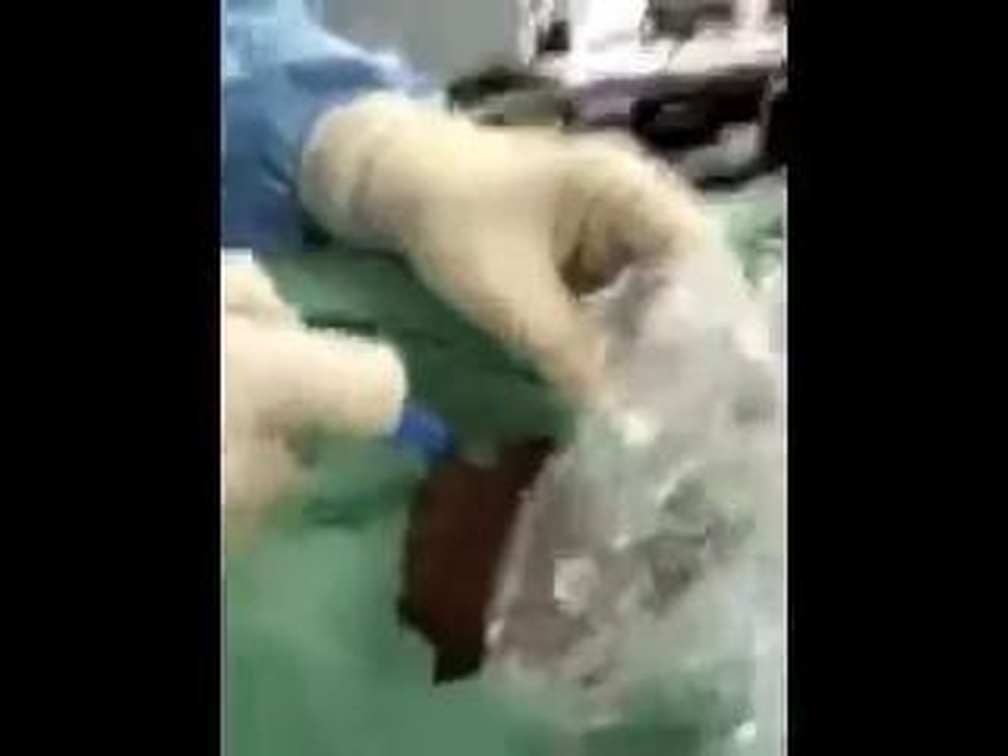We position the patient, put some gel on the patient, and ultrasound. Using the guided ultrasound, we actually put our needle in, and looking on the ultrasound, we can actually see the needle entering that vein.